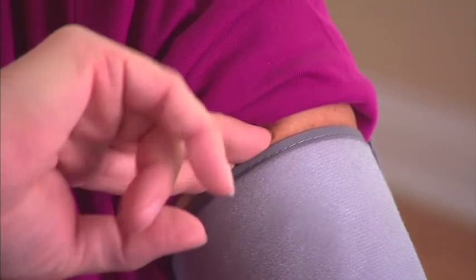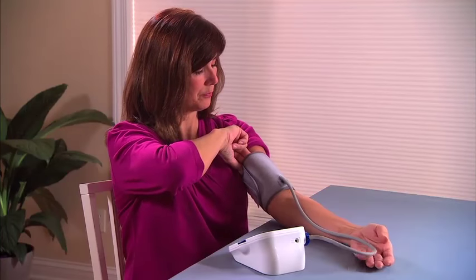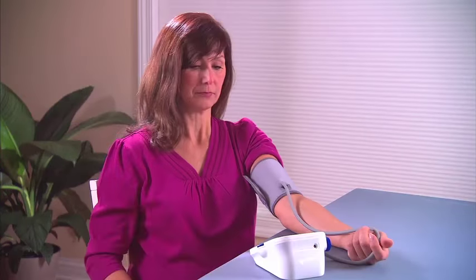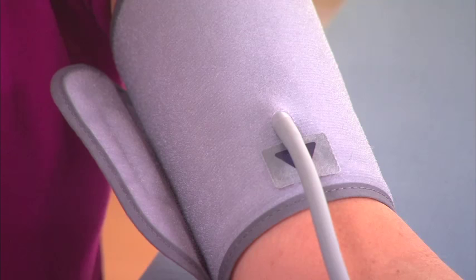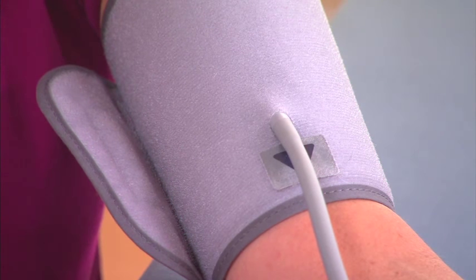You should place it tight enough so that you can only slip 2 fingertips under the top edge of the cuff. Make sure your skin doesn't pinch when the cuff inflates. To get started, wait a moment, then press start. Remain still and quiet as the machine begins measuring. The cuff will inflate, then slowly deflate so that the machine can take your measurement.